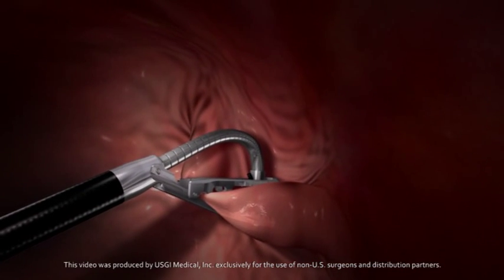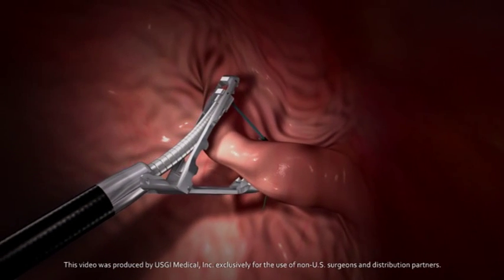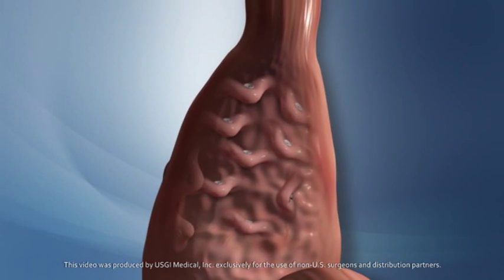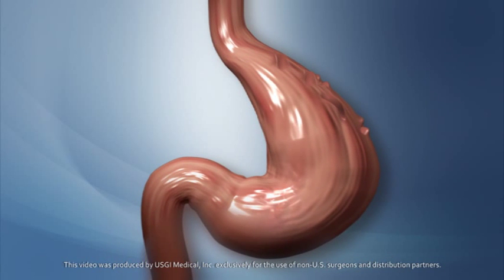The POSE procedure has been designed to help the body recognize when it has had enough food and to feel fuller faster with smaller meals. A sufficient number of sutured tissue folds are created in the stomach to achieve the desired results successfully without a single incision.